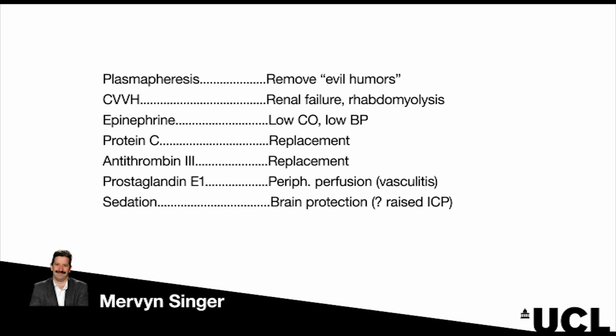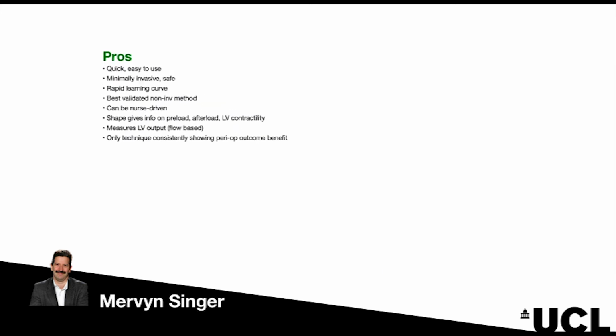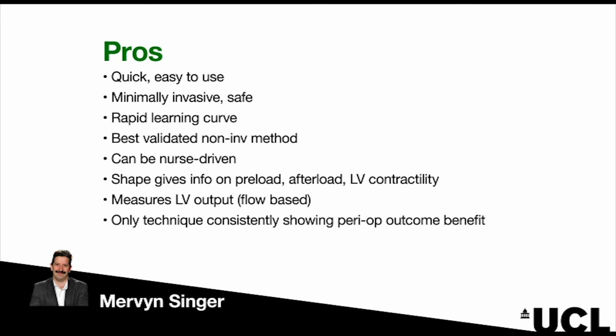And he looked better, his colour was better, and the Doppler monitor showed a much improved cardiac output. Thereafter, he had lots of different treatments and did very well, and eventually lived to tell the tale and went back home. So in summary, the advantages of the technique: it's quick, it's easy to use, it's minimally invasive and safe. There's a rapid learning curve. You've got to go up that curve, but it is rapid.